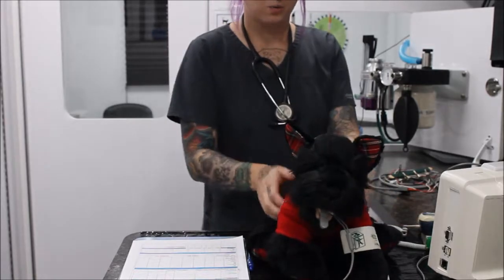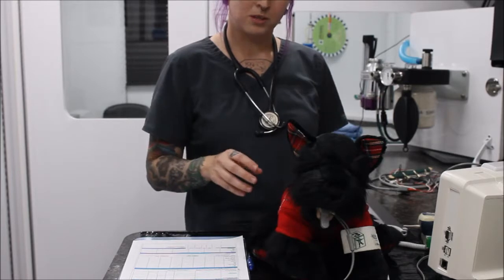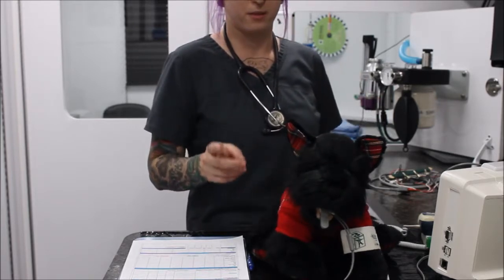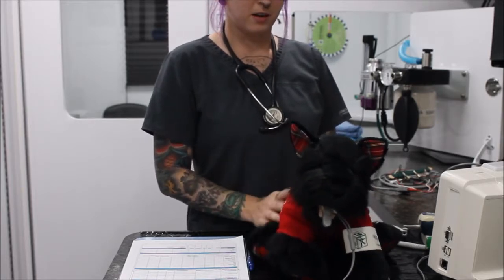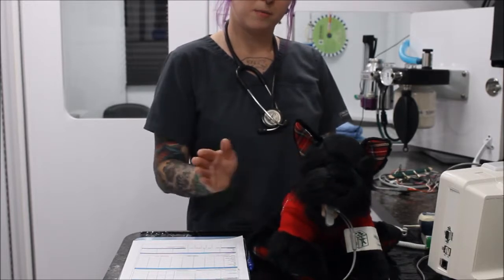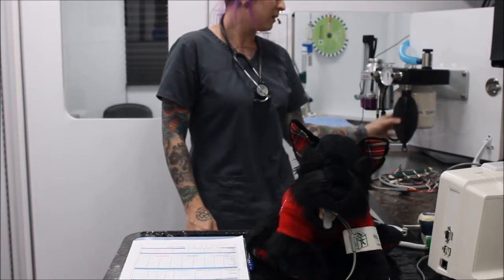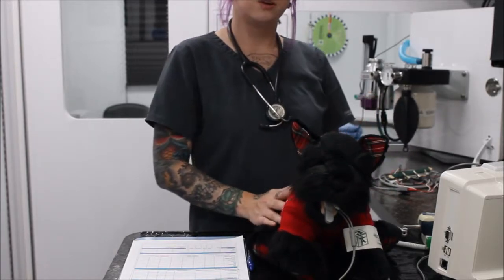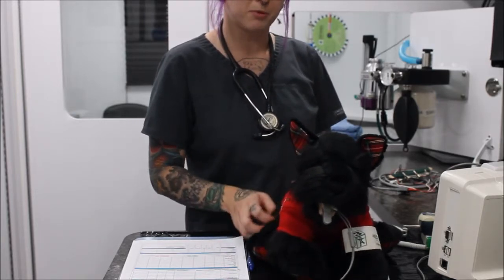So usually when they take one breath in and out, an inhale and an exhale, we count that as one breath. And the way that we monitor respiratory rate, we either count it manually by watching the chest wall move up and down. You can also watch the reservoir bag moving, and then there's also respiratory monitors and capnographs. Usually those monitor respiratory rate as well.